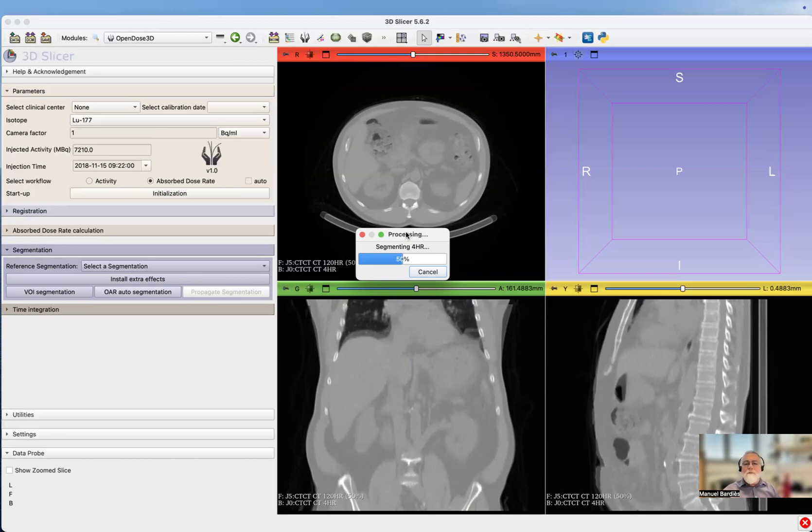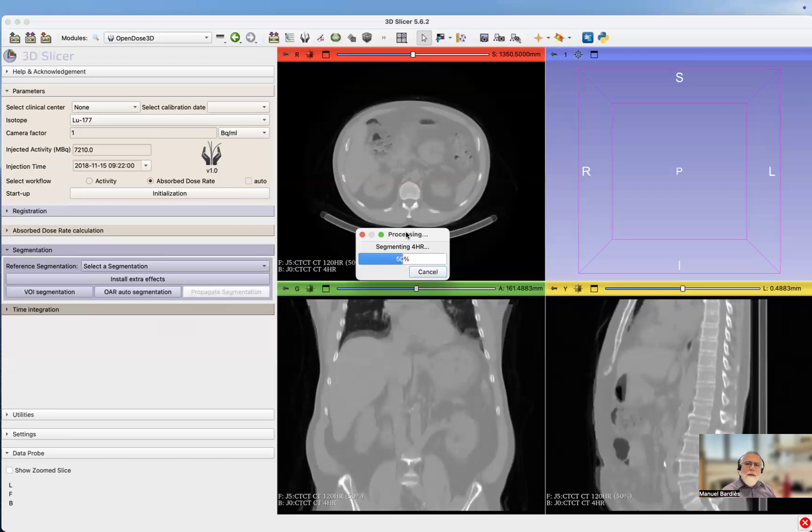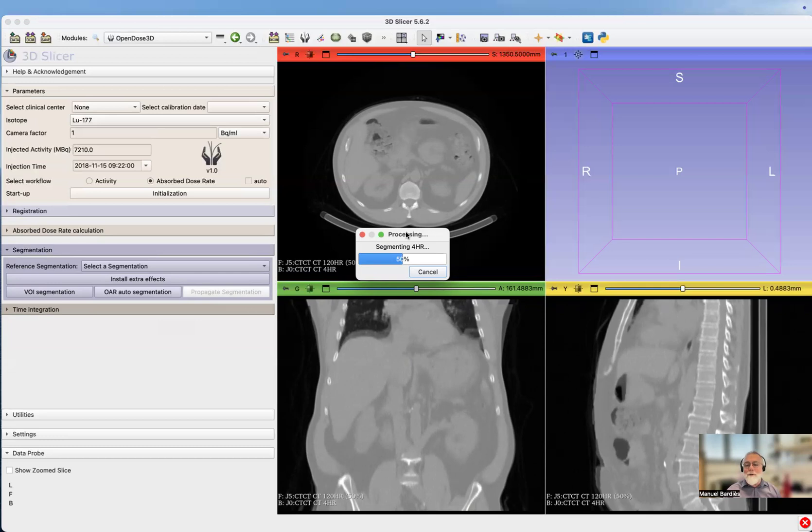Something to bear in mind is that Total Segmentator is very powerful. I think it has a list of more than 100 tissues and organs that can be defined. You have to be very careful not to select all of them because otherwise it would take forever to perform the segmentation. Obviously, having a GPU is going to help you a lot.